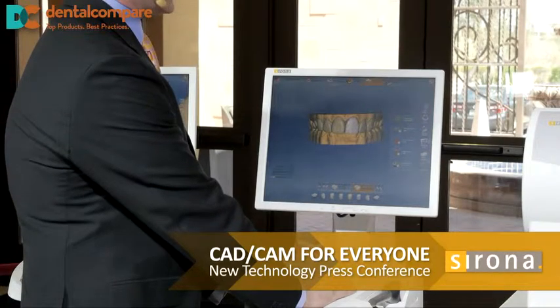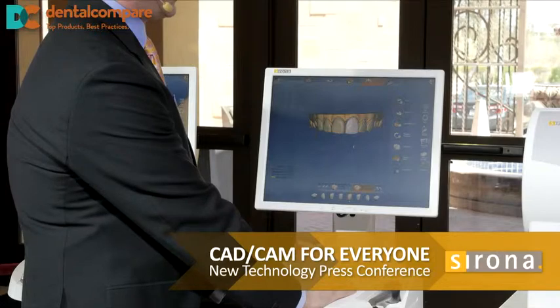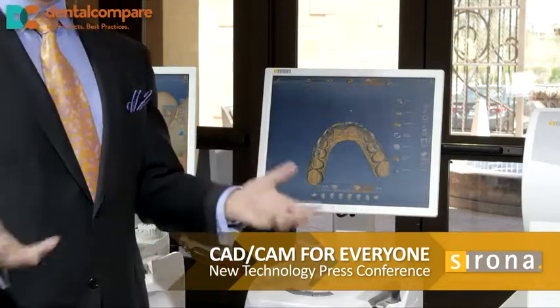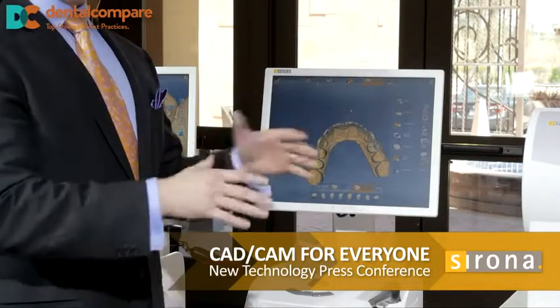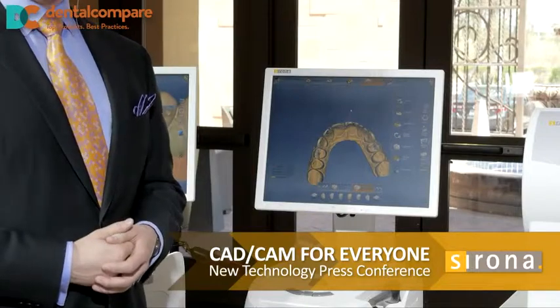and then if we want to, we can take a look at the tooth, and we can actually have the design mark where they're going to have interferences and remove them before we ever mill the restoration. That way, when we have some of our new materials that you can't necessarily try in, we can have them finalized, aesthetic, bonded into place, and we don't have to worry about making alterations after we put them in.